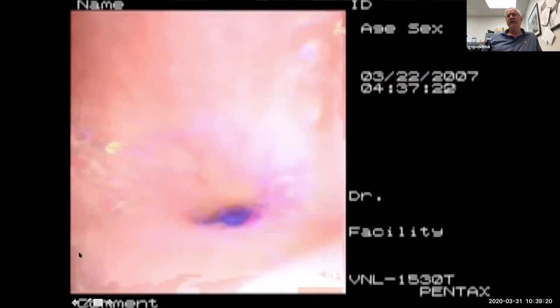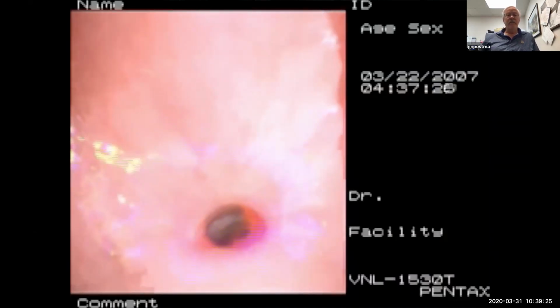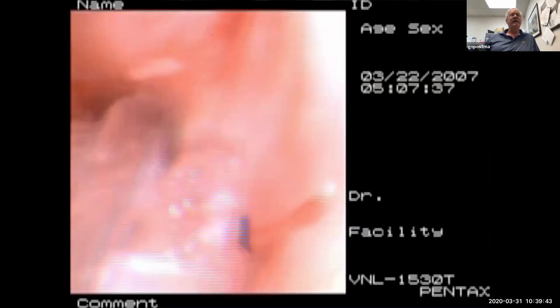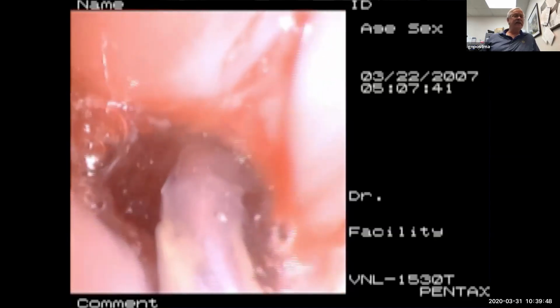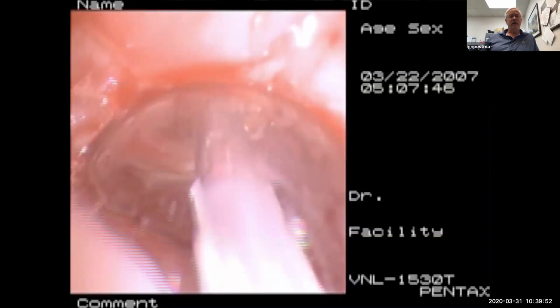We published a series of patients with nasopharyngeal strictures after radiation therapy and after UPPPs for sleep apnea. They developed nasopharyngeal strictures. You can't even put our flexible laryngoscope through that. So we're spraying lidocaine into this area, and then we're able to dilate this. And we had a great success rate. I think only one patient had to be dilated a second time. A lot simpler than rotating flaps into this area, and with a very, very high success rate.